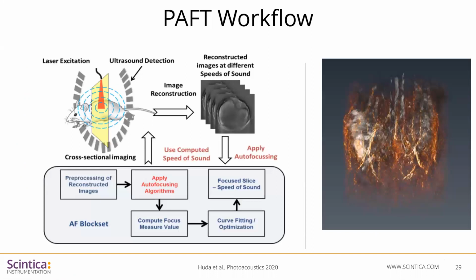Moving on to the PAFT workflow. On your left, you can see the PAFT workflow. Once the animal is imaged, cross-sectional or 2-dimensional images are captured. These 2-dimensional images are then constructed to form a 3-dimensional or tomographic image. The optoacoustic or photoacoustic images are tomographically reconstructed using different values of the speed of sound.